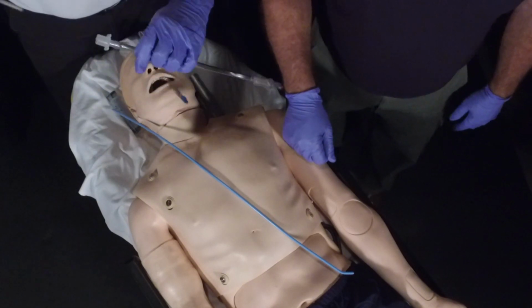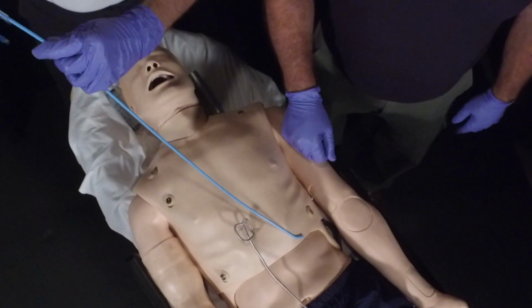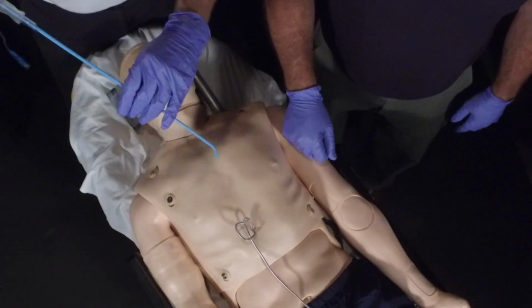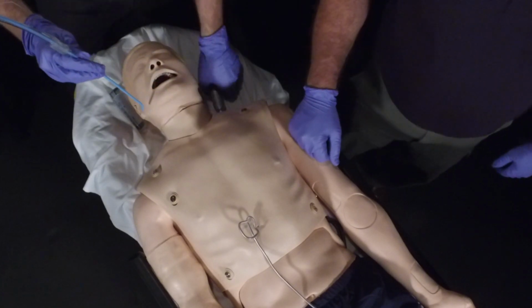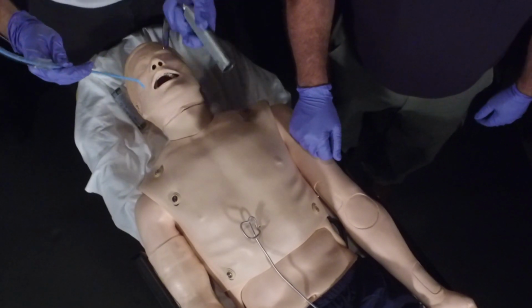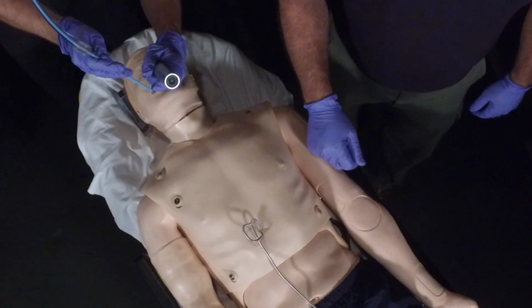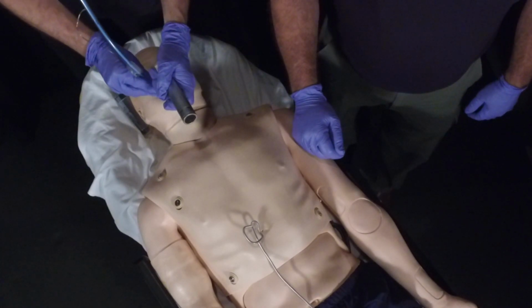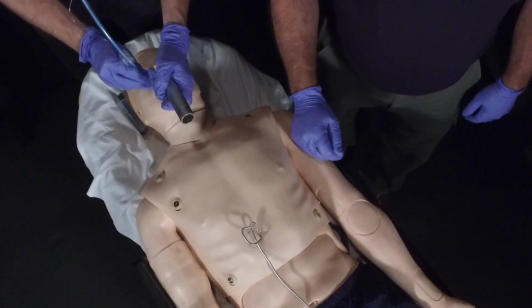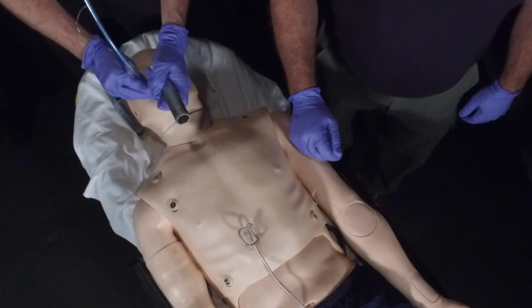We're then going to use our laryngoscope like we normally would, find the base of the tongue, attempt to find the epiglottis, lift the epiglottis as best we can, but understanding the anatomy, we would take the soft bougie stylet, slide it under the epiglottis to where the trachea should be, and as we slide it into the trachea, we're able to feel the tracheal rings with that curved end.